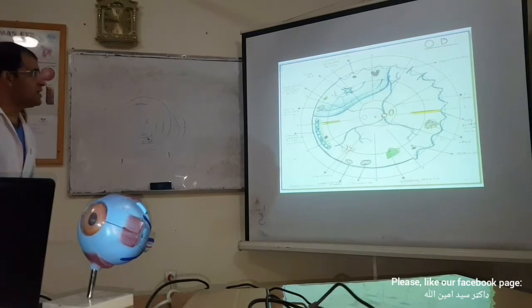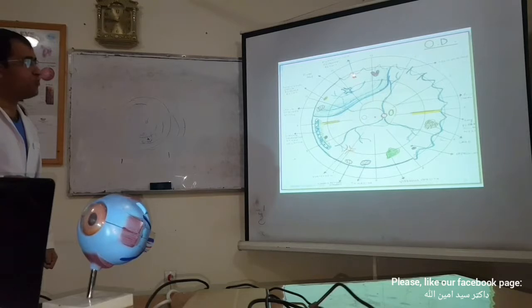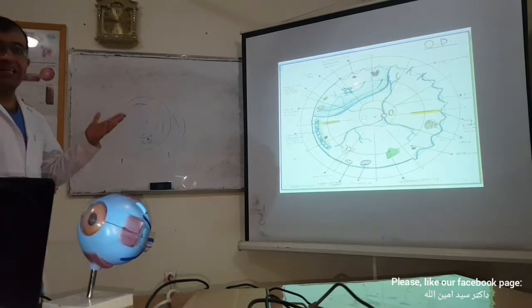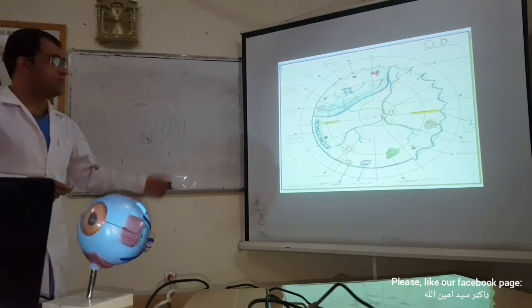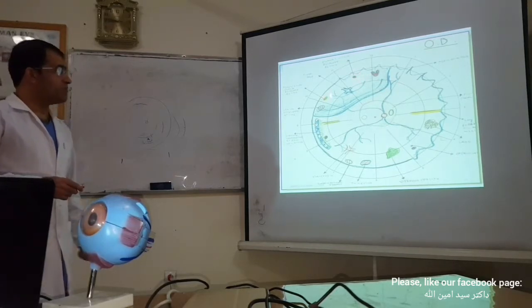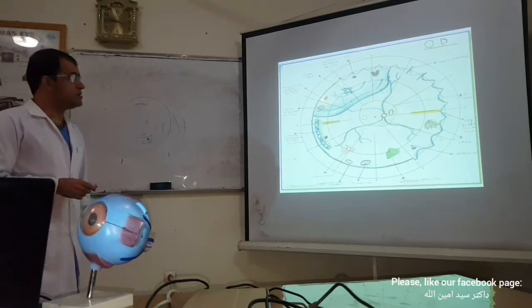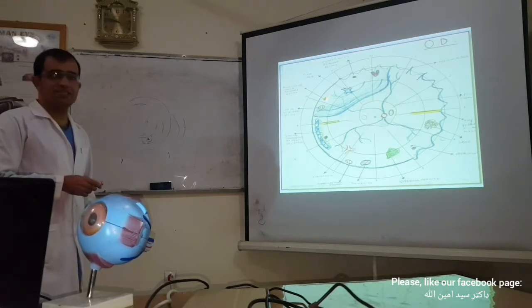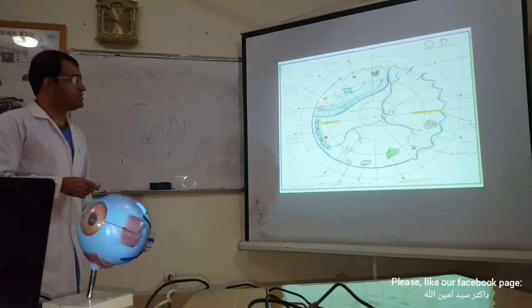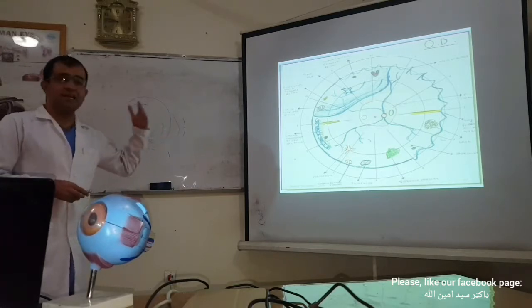And next again, what is this lesion? Retinal detachment. What is this lesion? Partial tear. This one? No pigmentation within the detached retina, not under the detached retina. If it is in the detached retina, again it's going to be in black color. What about this lesion? This is not seen clearly. It is pigmentation. No, do not read this. You just look to this. No, the color. The color is brown, only a brown color. That is pigmentation. Excellent, pigmentation under the detached retina.